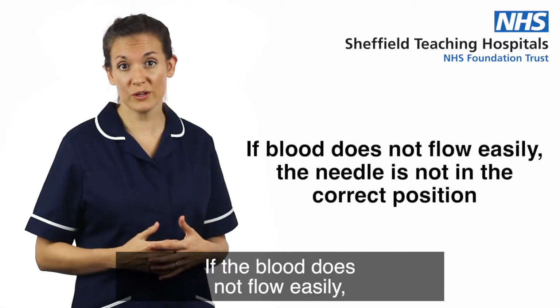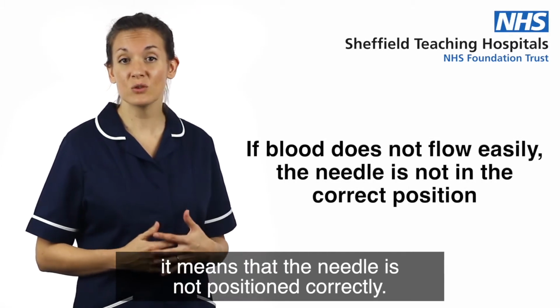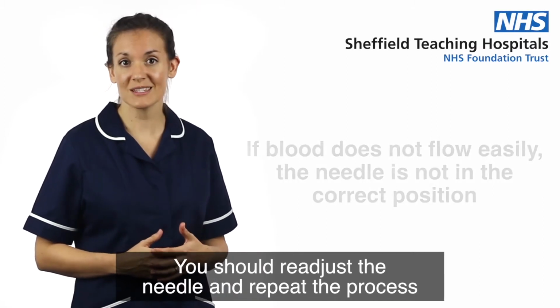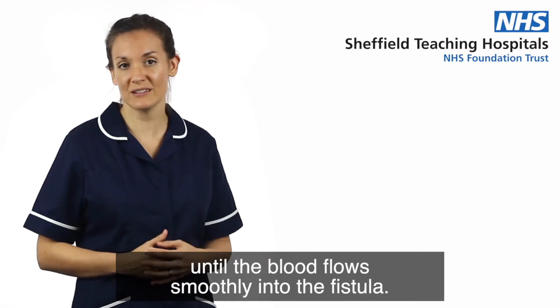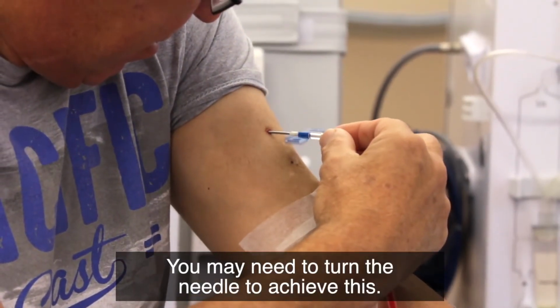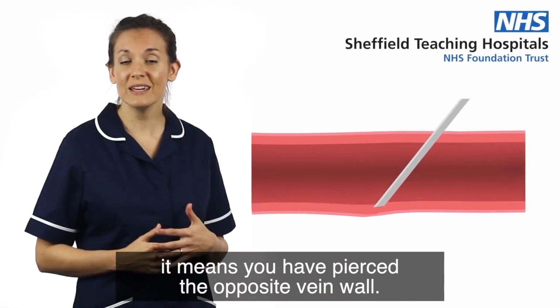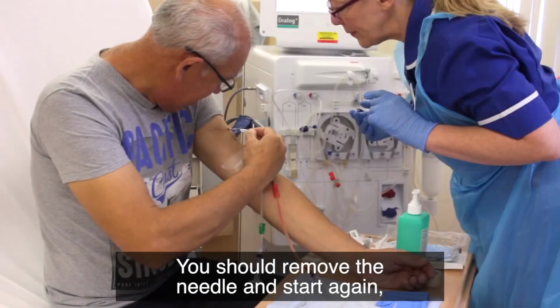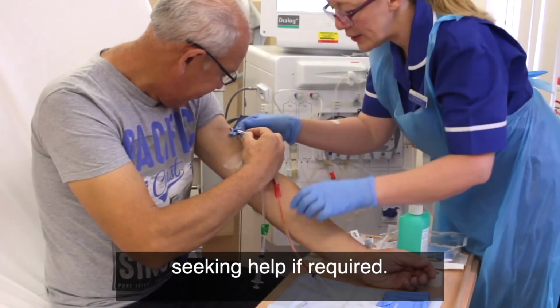If the blood does not flow easily, it means that the needle is not positioned correctly. You should readjust the needle and repeat the process until the blood flows smoothly into the fistula. You may need to turn the needle to achieve this. If it is painful and the area starts to swell, it means you have pierced the opposite vein wall. You should remove the needle and start again, seeking help if required.